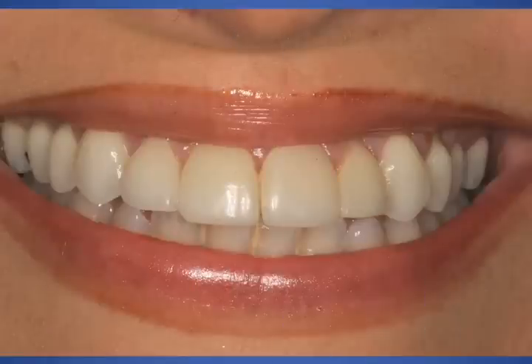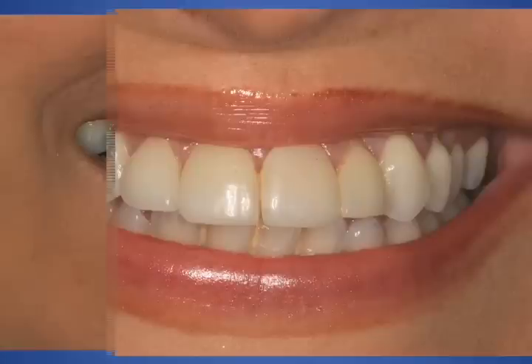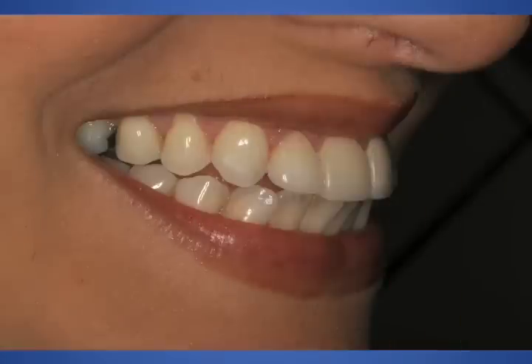So let's look at our patient right now. This is the preoperative photograph of her high smile line. The lateral incisors and two maxillary central incisors are fairly mobile. She has some real concerns with aesthetics and function. She'll tell you that she would not be able to bite into a breadstick or feel comfortable going to a restaurant. She felt that she was going to lose those two teeth shortly, which affected her emotionally.